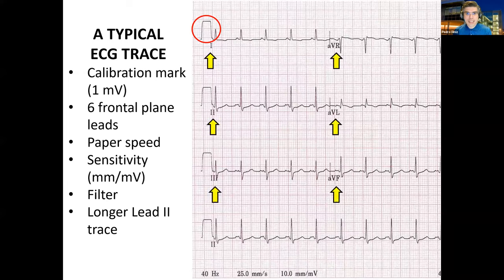Next, you should look for the leads that have been captured on that ECG. In this case, we see the markings for lead 1, lead 2, lead 3, AVR, AVL, and AVF — these are the six frontal axes of the ECG.